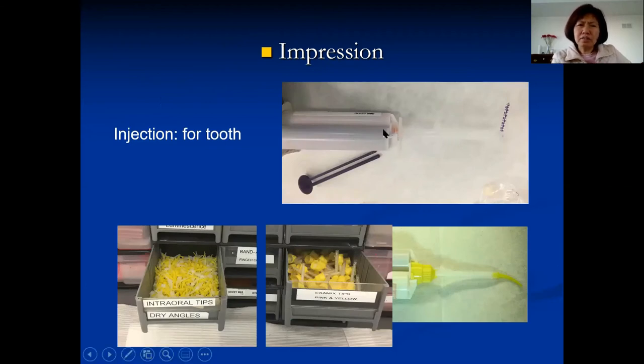We also have material that comes out of a machine — two different machines, same principle — with different consistencies. Always double-check everything is clean and the material flows before loading on the teeth. For the material with Impregum, each has a different light body. You flip it open, the material flows into the tip and mixes there. Load it, push it, and the material mixes at the tip when you inject it. I like the yellow intraoral tip — it's smaller, easier to control, and easier to get into the sulcus.